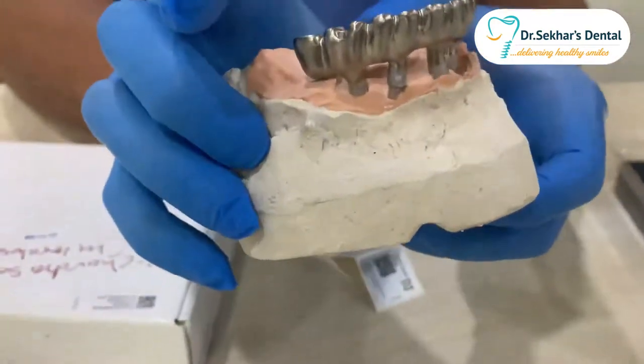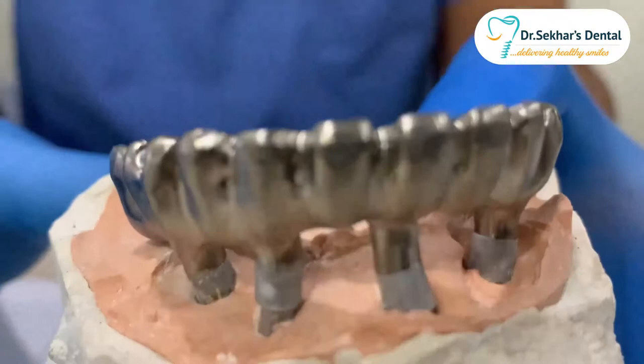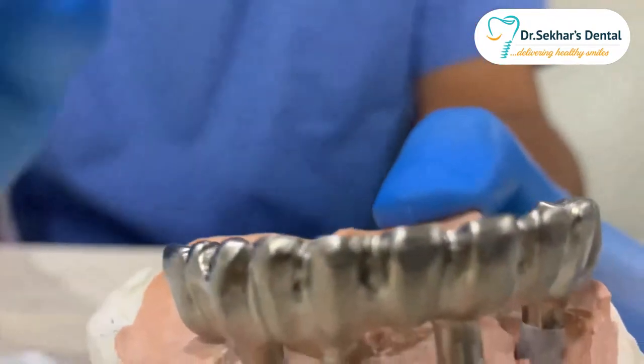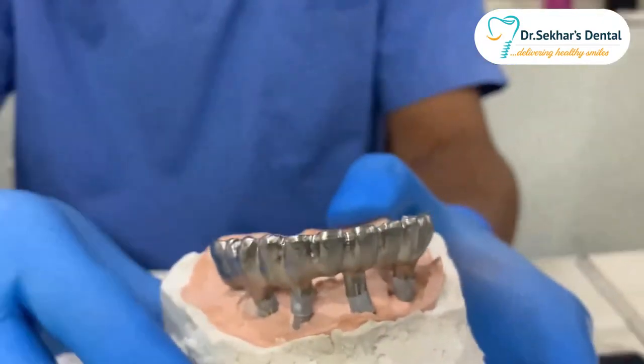If you closely observe on the working cast, the precision and the accuracy of the seating is so perfect. I just opened it up and seated it without any modifications done to the frame.